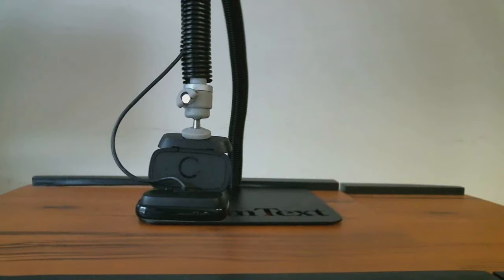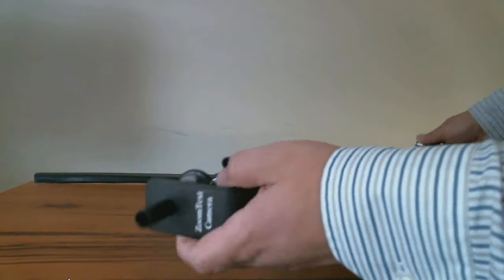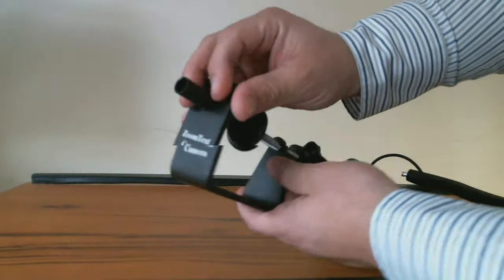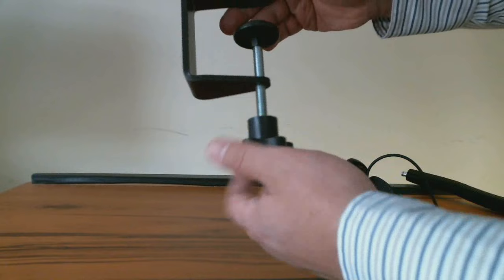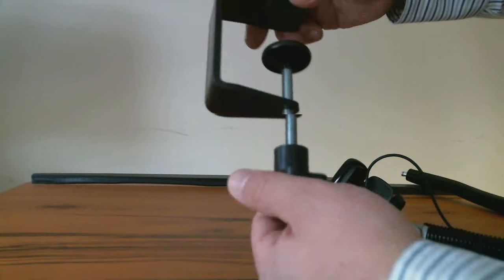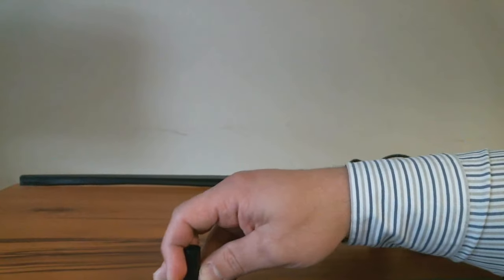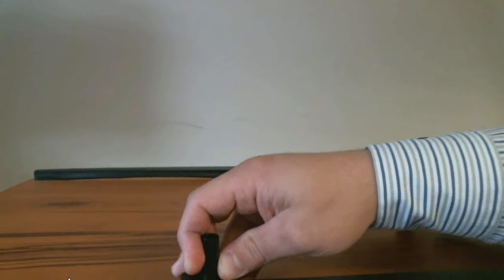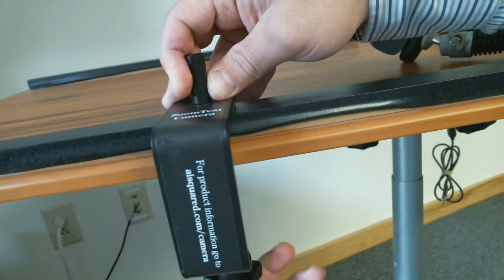setup guidelines. I'll just show you real quick how the C-clamp works, just so you can get an idea of that. So I'm going to go ahead and unplug this. Take this out of here. So here's the C-clamp. And again, the camera is going to attach right there, and it has this right here where you can tighten or loosen it depending on what you're attaching it to. For the most part, most surfaces you're going to be able to attach this to. You might need to screw it in more or less depending on what you're attaching it to. In this case, I have to tighten quite a bit.